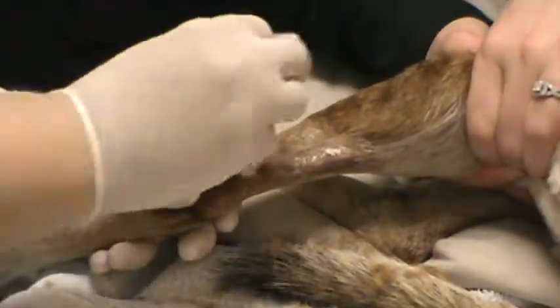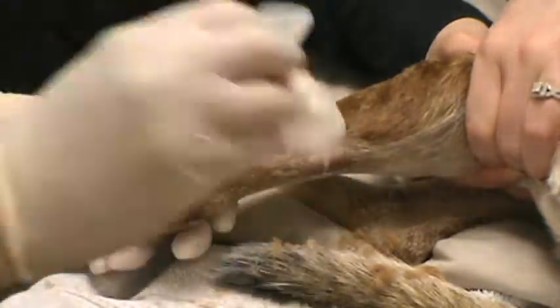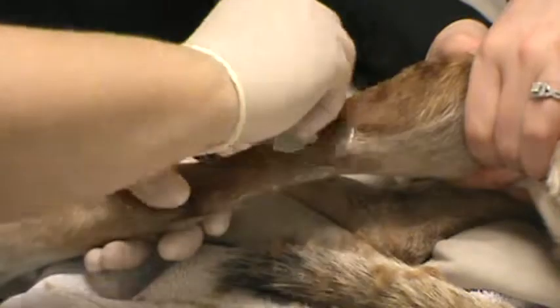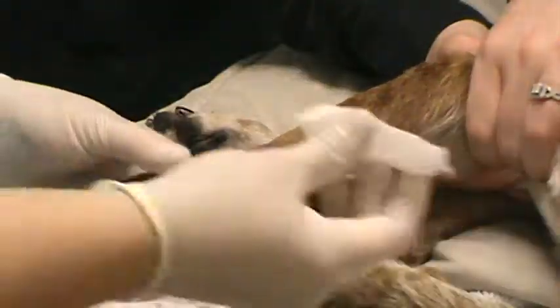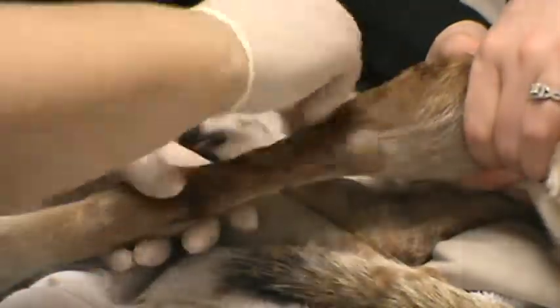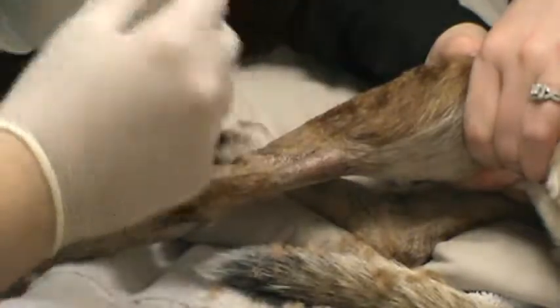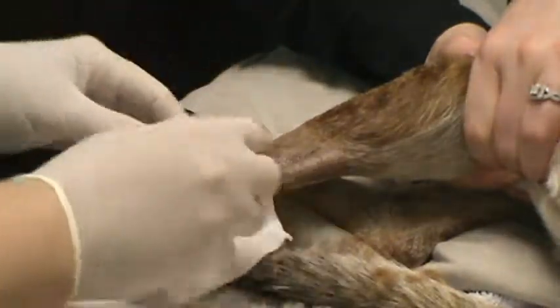Then alcohol again, and one more chlorhexidine scrub. And then one more alcohol wipe. We have our dry gauze here to make sure that we don't run our catheter through any hair.